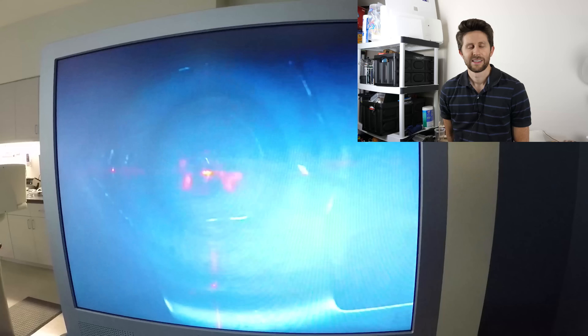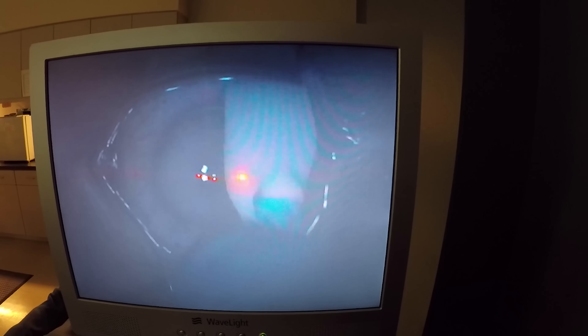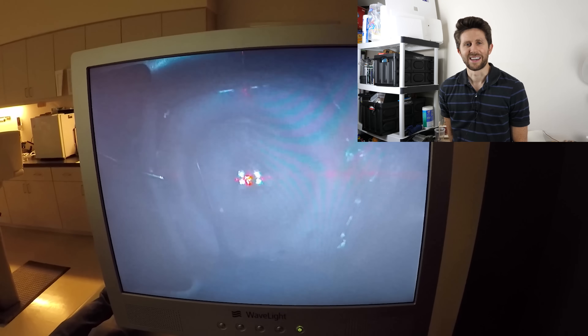Then he puts the corneal flap back down. You can smell burning flesh — it doesn't cause a burn, it certainly smells like it though. These drops are some of the drops that you'll be using with your medication. Now the other eye.